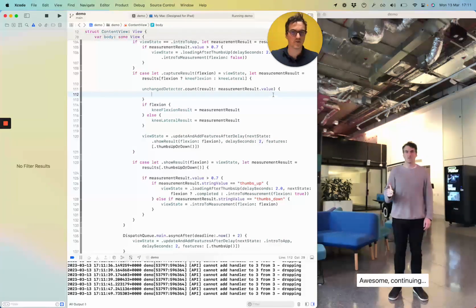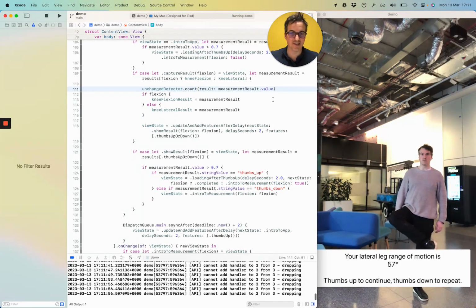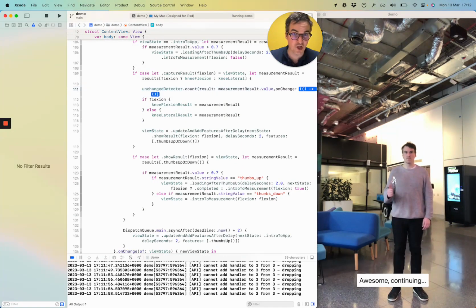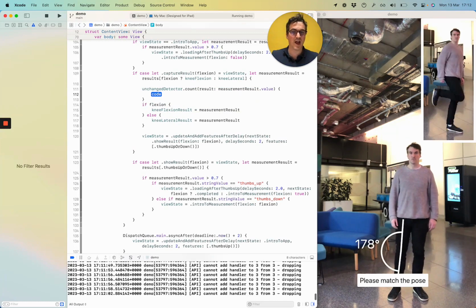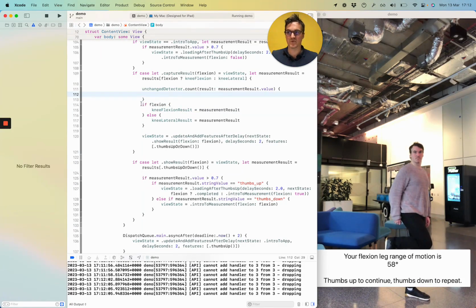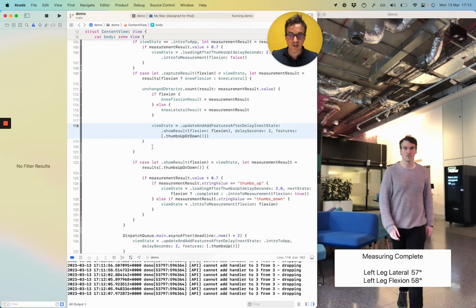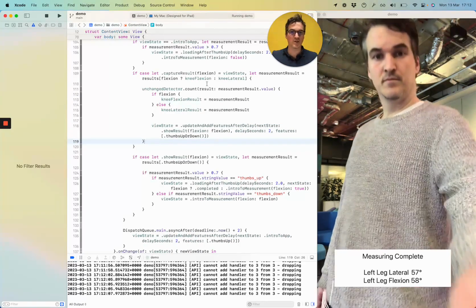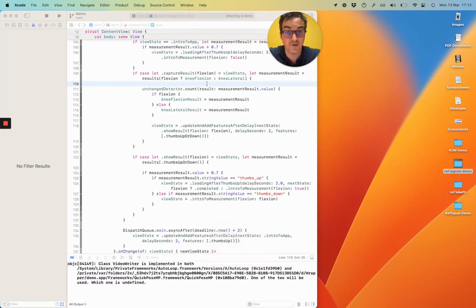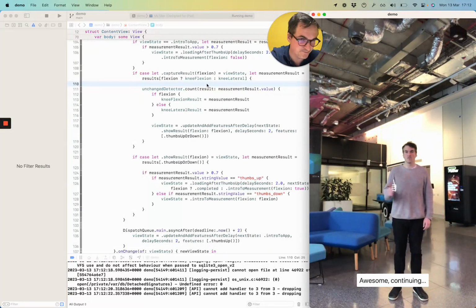The callback here is when the value has passed its limit. So I was sort of expecting a prompt on change. So this is when the change has happened, it has the callback here. And then this is where we want our code to live. So we want to say only when the value has unchanged for a short amount of time, or unchanged, then that's when we want to capture the result. So let's see what happens here.